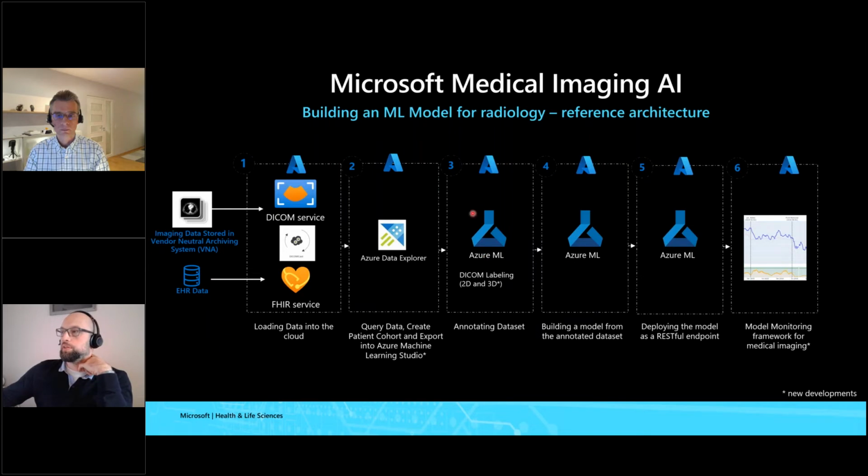And once that is done, we have Azure Machine Learning, which is available for many of the subsequent steps: annotation, building the model, experimenting with different architectures and so on, and deploying the model as an endpoint. So that's also a part of the Azure Machine Learning platform. Once the model is trained, Azure Machine Learning can automatically deploy it for you as a managed endpoint and a container service for which you can also provision compute resources, and then it will run behind a secure RESTful endpoint. And also within my team, we have some focus right now on the annotation.